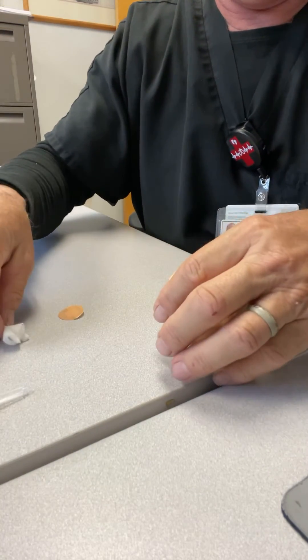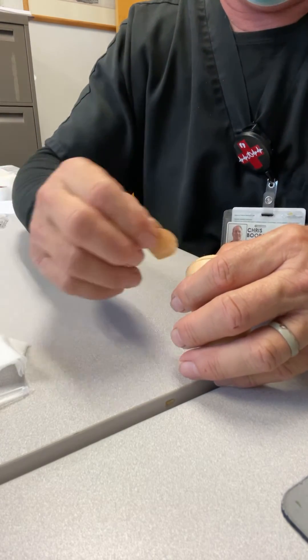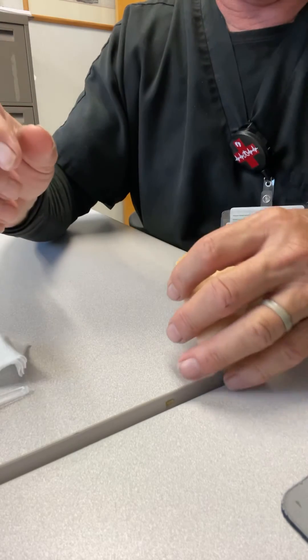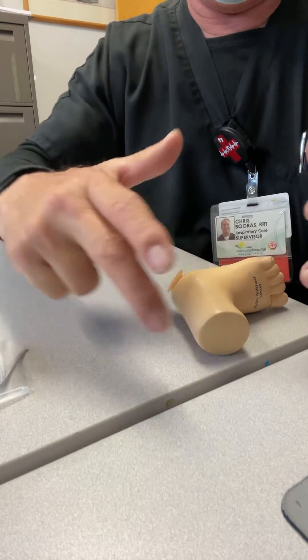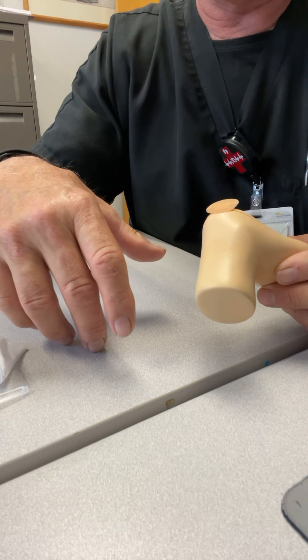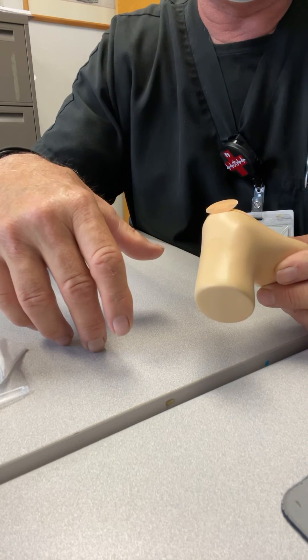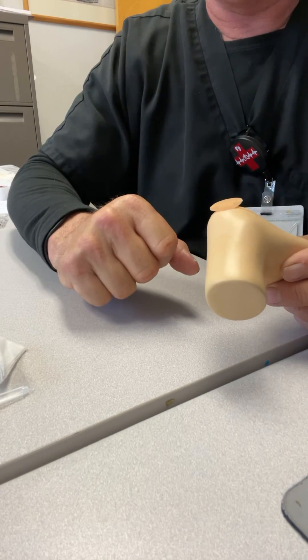Once you're done, wipe your blood off and stick your little band-aid on there — you're good to go. I like to put a washcloth under the baby's heel so you don't get the nurse's bed wet with blood. They would not be happy with you, so protect the area. Keep your nurses happy.